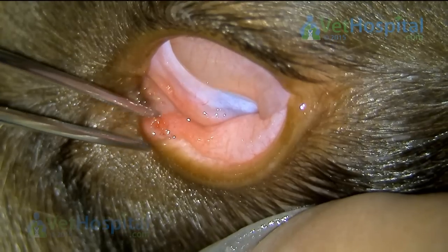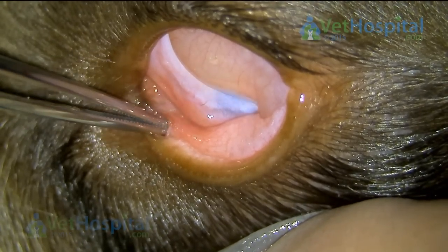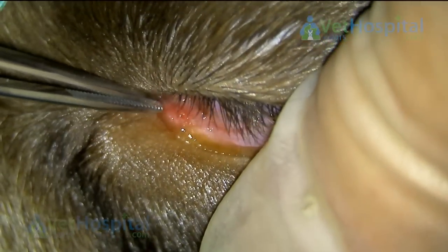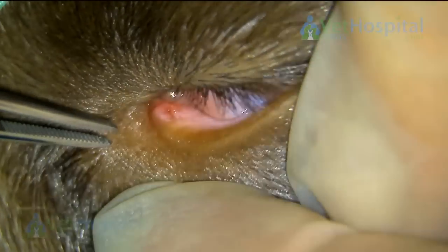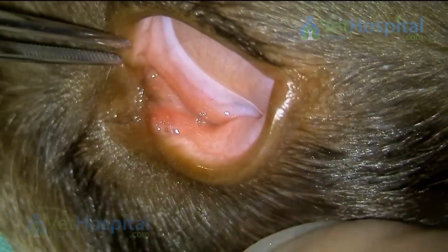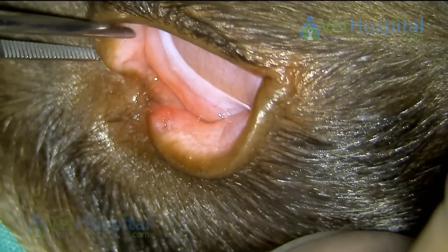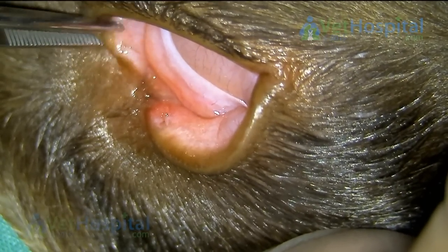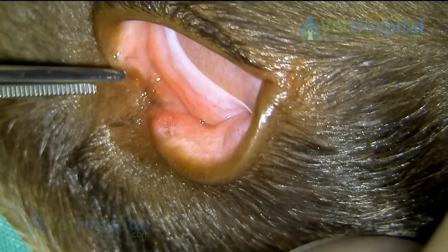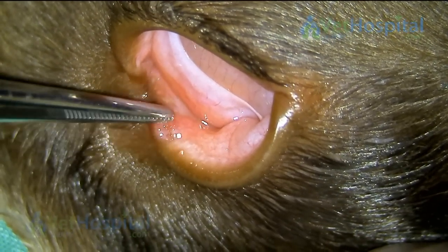So careful examination is absolutely essential in these situations. Just making sure there's no other foreign bodies left in there. We also check the upper puncture as well, and that appears to be fine. We've already checked behind the third eyelid and the rest of the conjunctival sac.